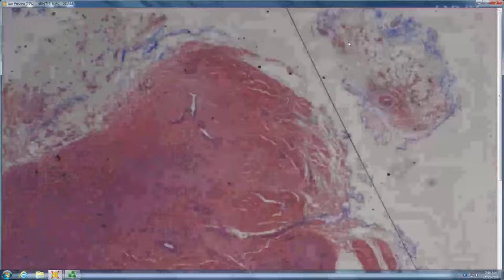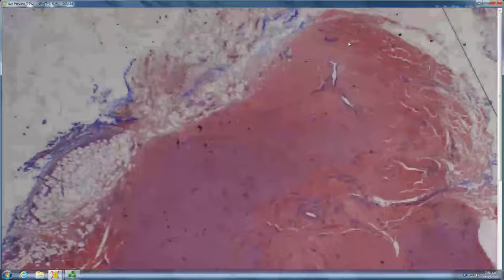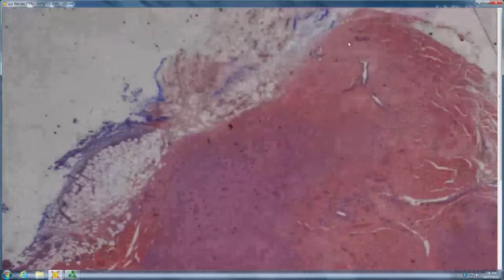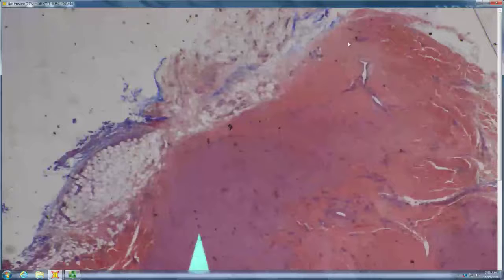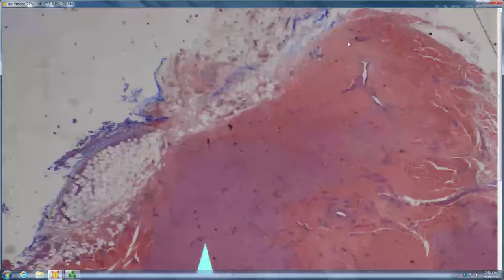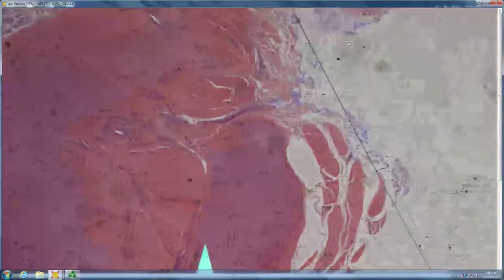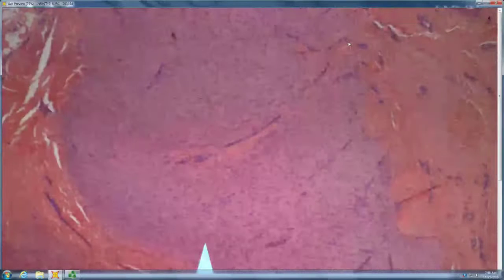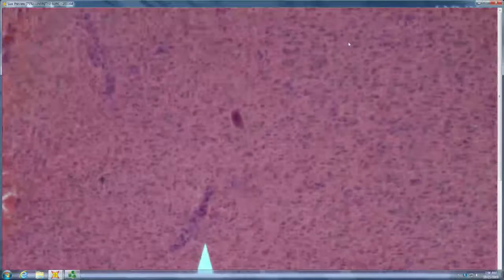Looks like an adult myofibroma. So sort of like an adult myofibroma, except do you have hypocellular bluish areas in the cores of the nodules, or are they uniformly cellular throughout? Looks uniform. Okay, so that doesn't really fit for myofibroma, which should have distinctly hypocellular bluish centers. Yeah, too cellular. Maybe neurothekeoma.